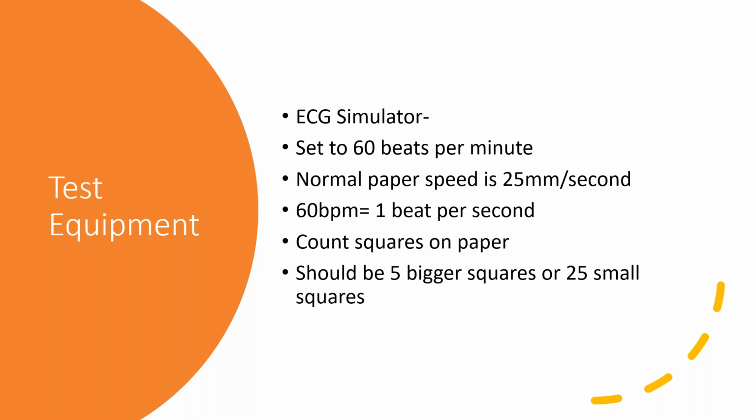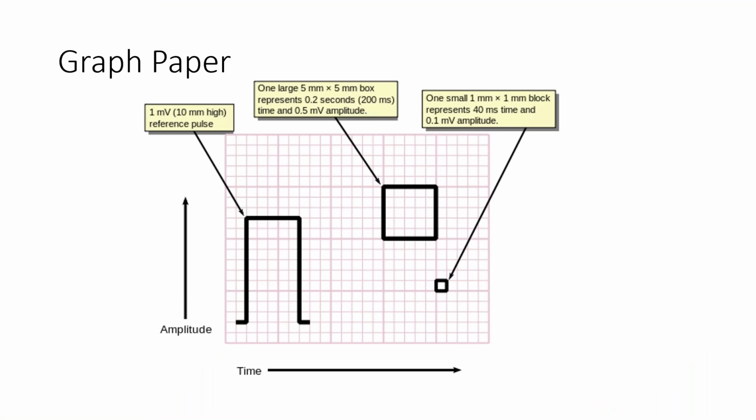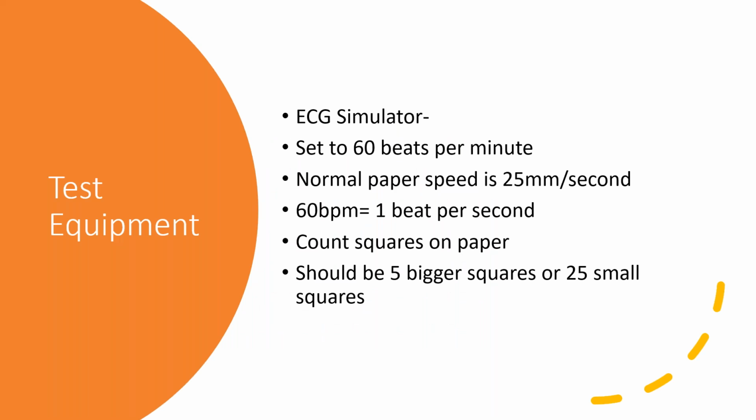ECG simulator. When I refer to an oscilloscope, a lot of people don't really use oscilloscopes anymore. Most new techs, I don't even know if they teach oscilloscopes in school anymore. It was one of the things that we learned a lot on when I was in biomed school a long, long time ago. But when I say it's just like an oscilloscope, I get a confused look on some people's faces, like, okay, I need to explain that a little bit more.